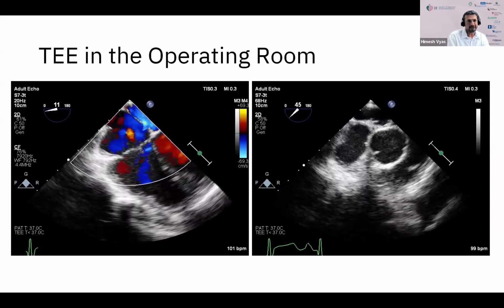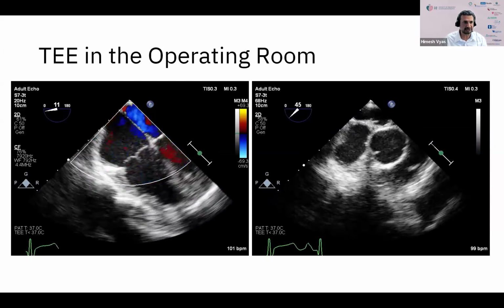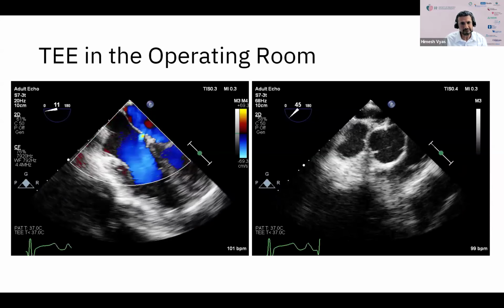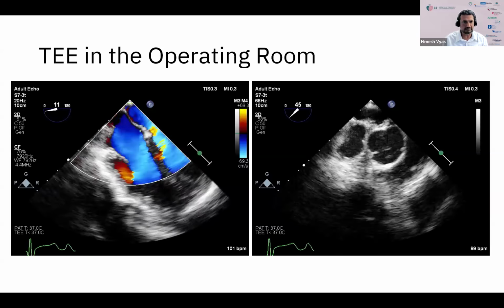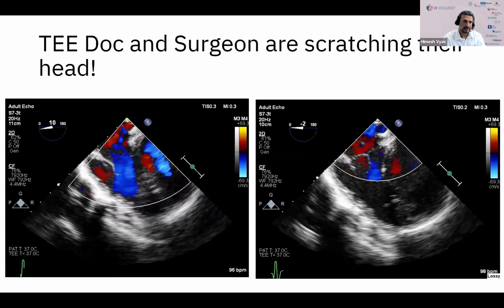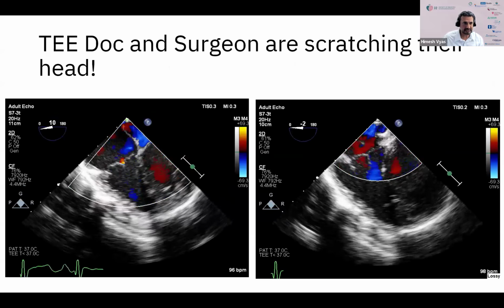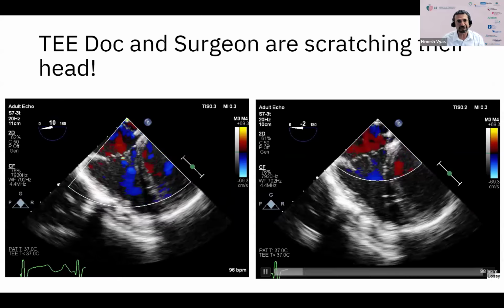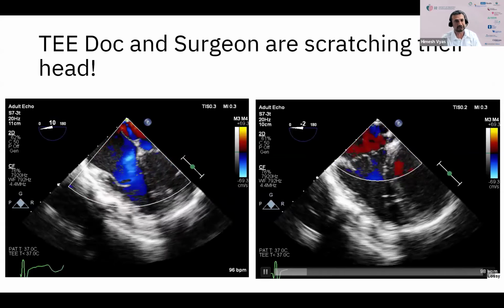And a TE performed in the operating room is shown here. So some of the transesophageal four-chamber views, there's a small fenestration that you can see here with left to right shunting. And then a short axis view that shows a pretty intact looking atrial septum higher up. We knew that there's a fenestration lower down by the IVC entrance, and so we get some more imaging. There's maybe an additional smaller fenestration, maybe another fenestration by the coronary sinus. So a couple of small fenestrations, but nothing that looked really significant.